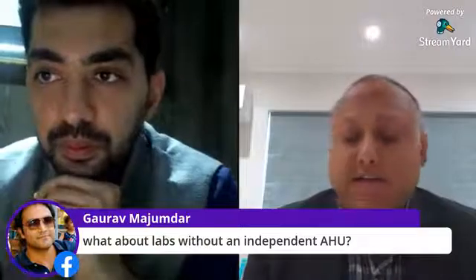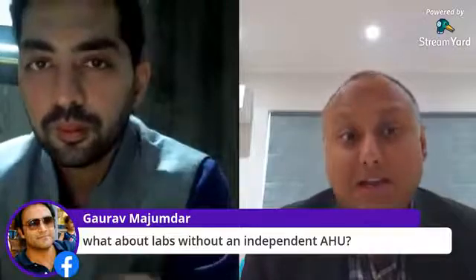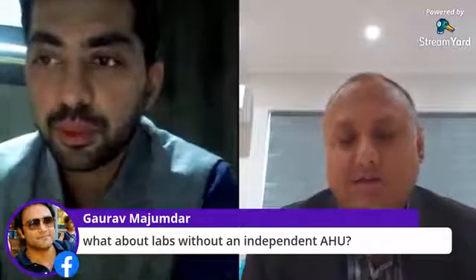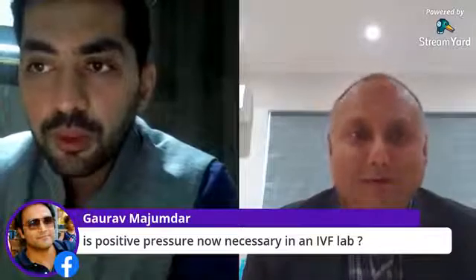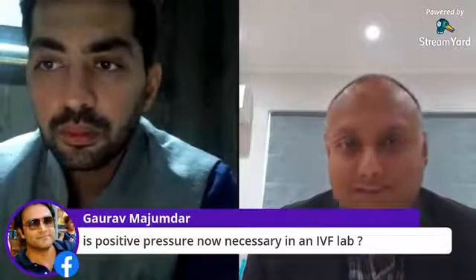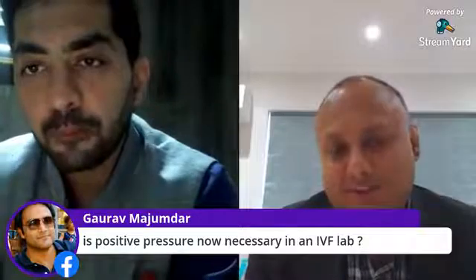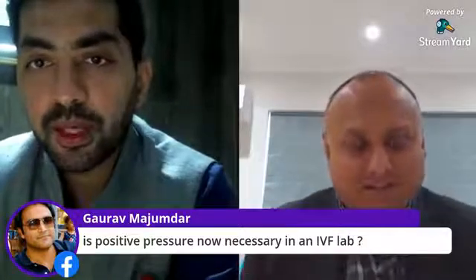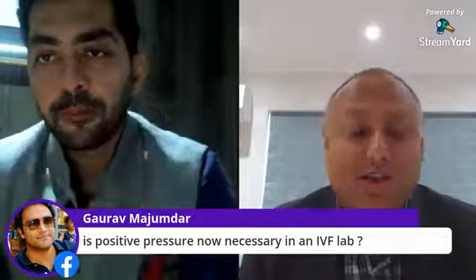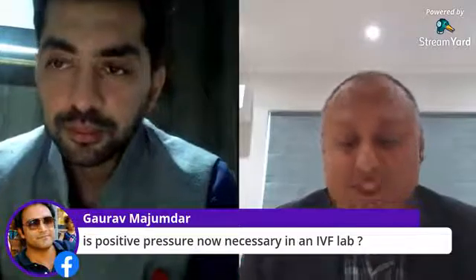So in the UK, certainly there's a regulation that if you do not have positive pressure in your lab, you can't be licensed to do IVF. So from my perspective, that is quite important to have positive pressure. And in the current scenario where we're dealing with pathogens and viruses, it makes it that much more important for labs to have positive air pressure to protect everything that we're doing essentially in the lab, and to keep contamination out, even in the form of their infection control policy. So that is very important.